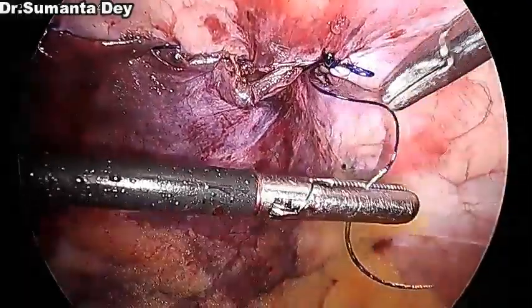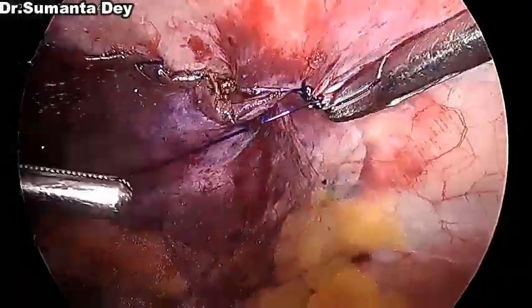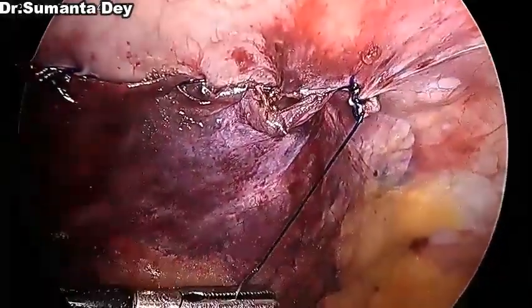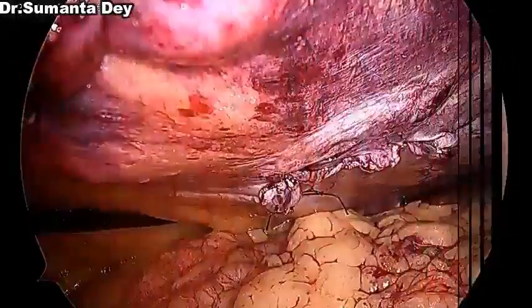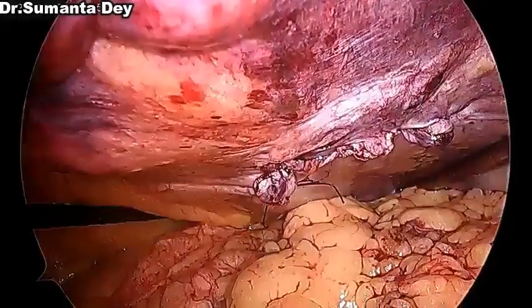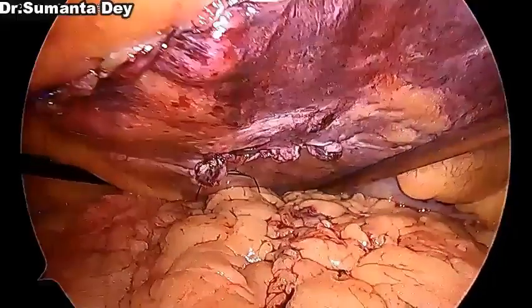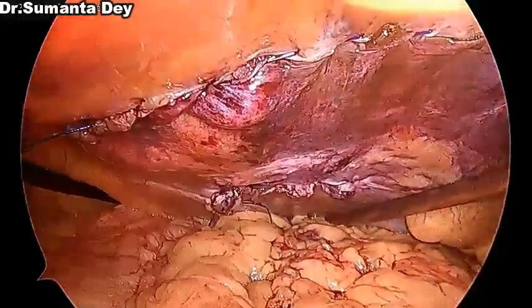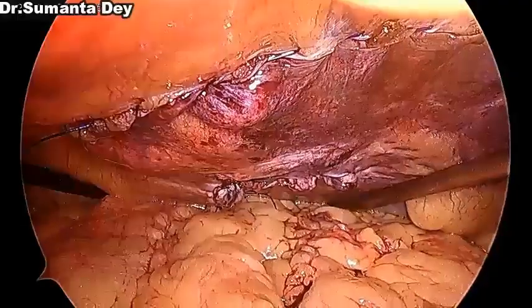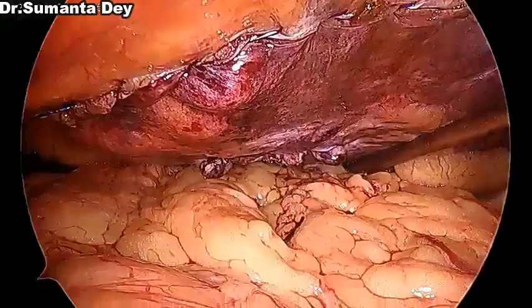I have seen videos on YouTube and Facebook pages of people sharing this. That's a complication of barbed suture. So that is done. I closed the peritoneal rent, and now under vision, I am gradually deflating the pneumoperitoneum. That completes the procedure. The operation took around 120 minutes, and the patient was discharged on the first post-op day. The patient is doing well in the postoperative period.